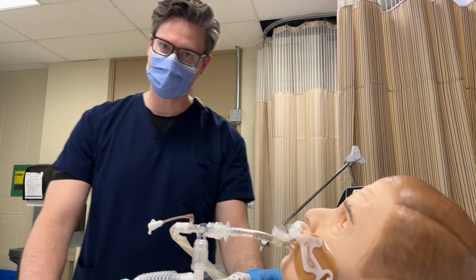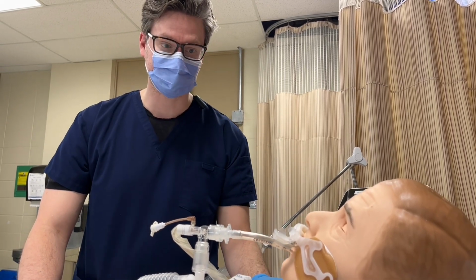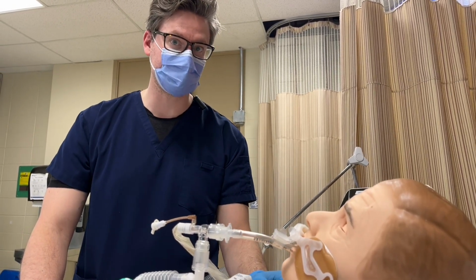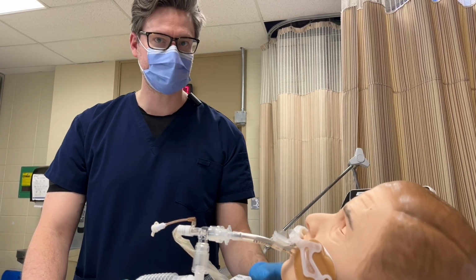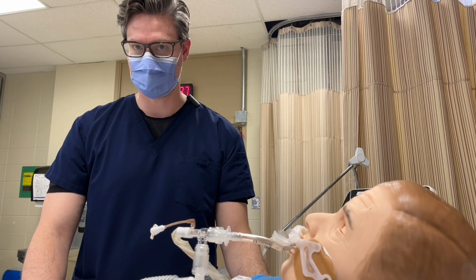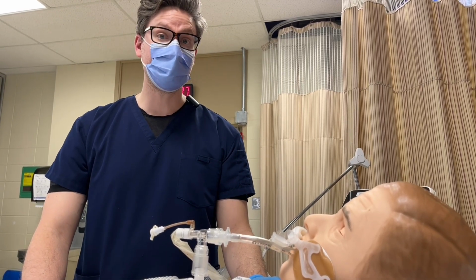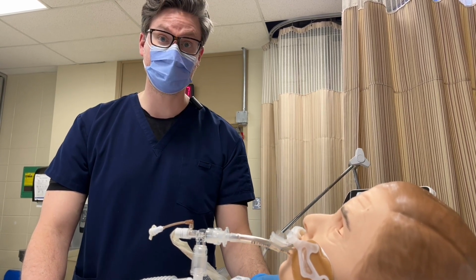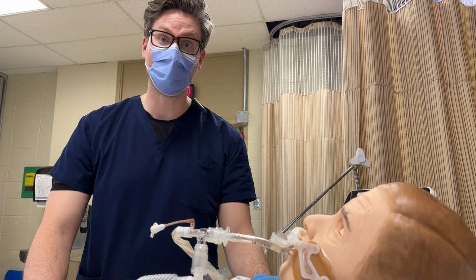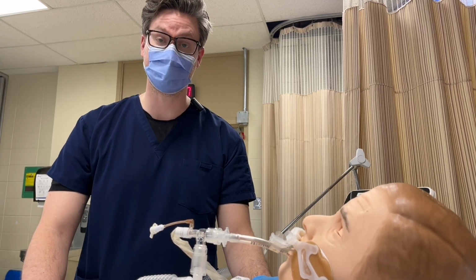What size of endotracheal tube did you note on your patient? What was the depth at the teeth? Did it match the monitoring record of the last check of your patient? Was there any skin breakdown around the mouth, tongue, or any issues with the teeth? We moved the patient's endotracheal tube from the right side of the mouth to the left. The endotracheal tube should be moved at least once every shift to help reduce the risk of breakdown of tissue around the mouth.